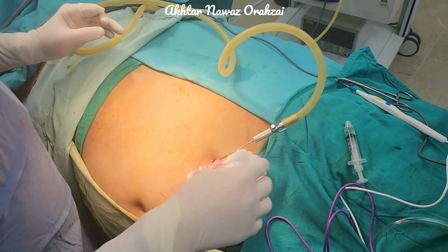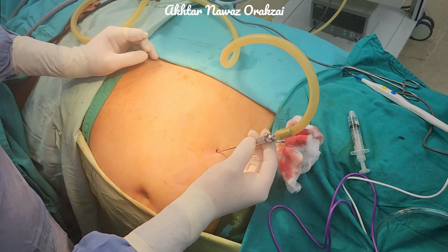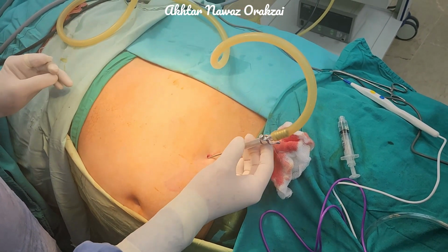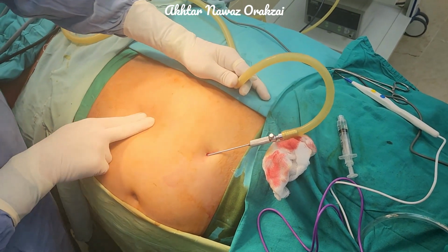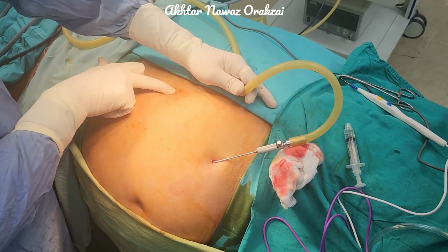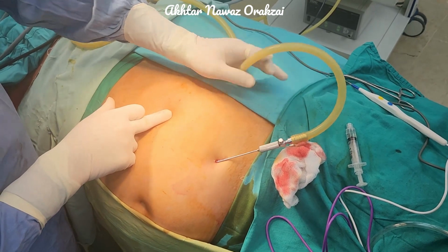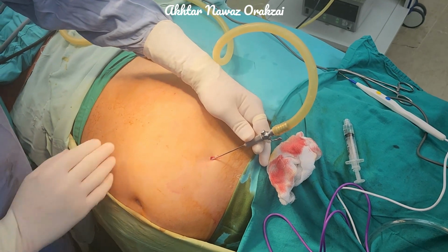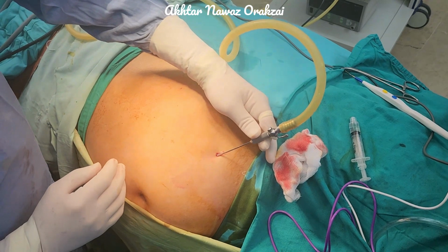So there is symmetrical distension of the abdomen. So we are in the right space. As I said earlier, the landmarks change. Now you can see that the landmarks have changed. The skin which was here before the pneumoperitoneum has moved here. So if we put in ports or decide the port placement before the pneumoperitoneum, all the anatomy will change and the procedure will become difficult.